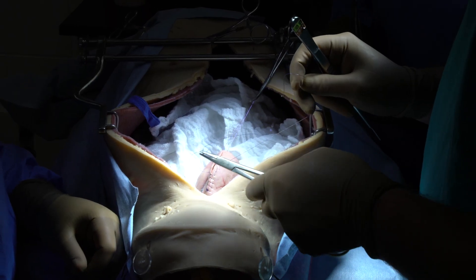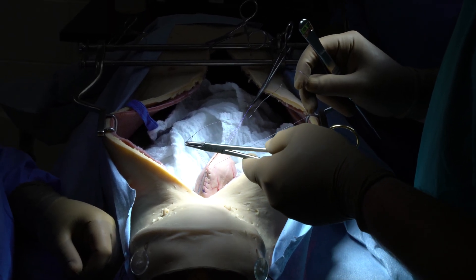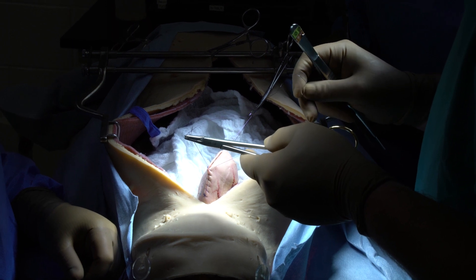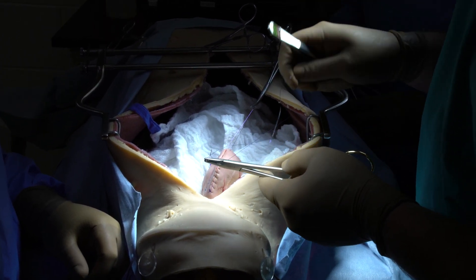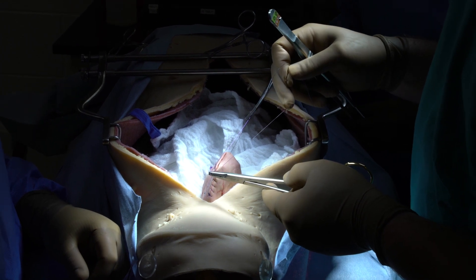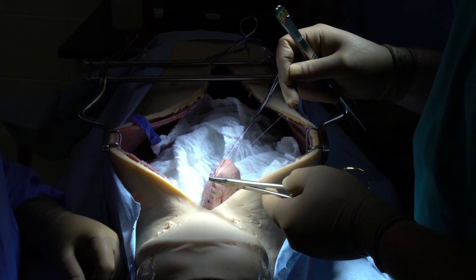Use your needle here to grab the loop, pull up — that's going to tension the previous sutures that you placed — and then pull it down, and as you pull it down you're going to be able to put it in the position that you want the suture to lay.